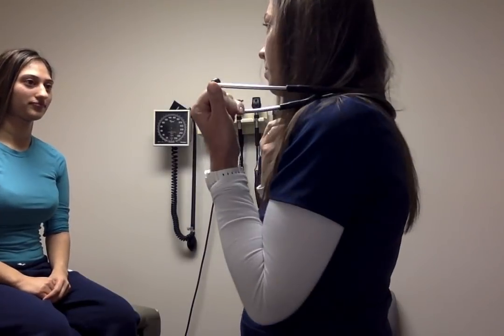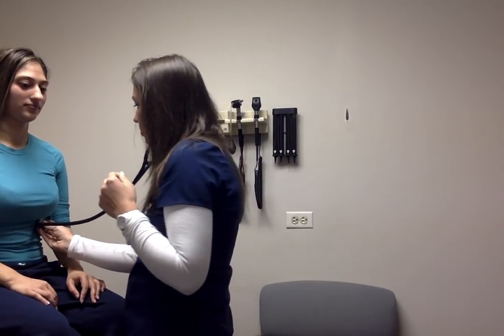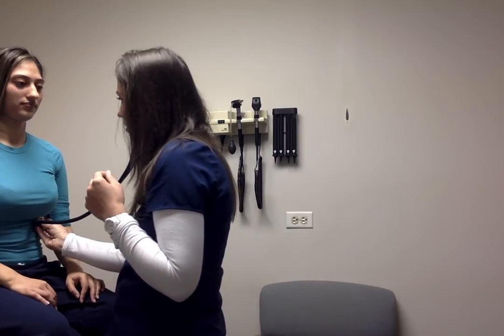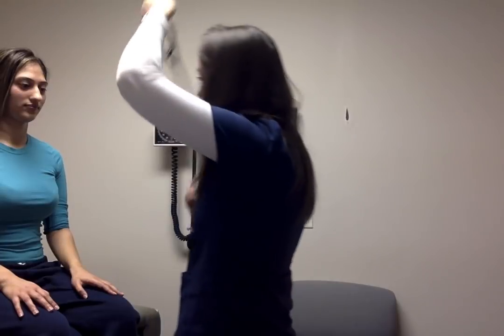Next, we're gonna check your apical pulse for 1 full minute to see if S1 and S2 are present. And I'm gonna listen for 1 minute. So S1 and S2 were noted. Next, I'm gonna listen for your heart sounds.